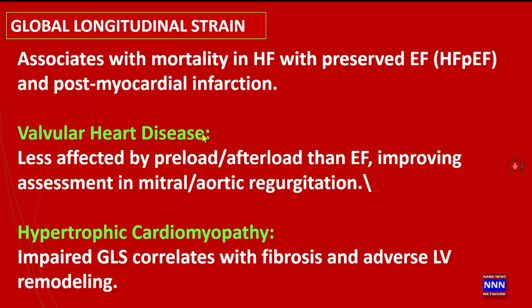It's also useful in patients with valvular heart disease. It is less affected by the preload and the afterload, as we see with reference to the ejection fraction. And as I said, again, with valvular heart disease, there could be patchy areas of myocardium depending upon which part of the myocardium is stressed, resulting in reduced longitudinal strain.